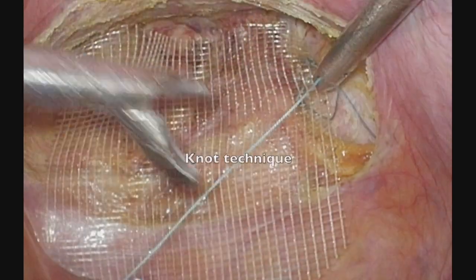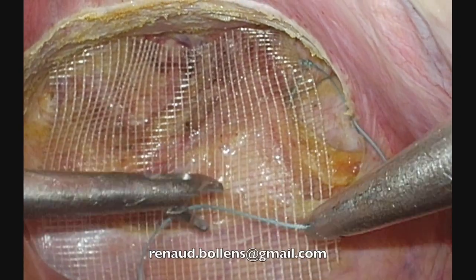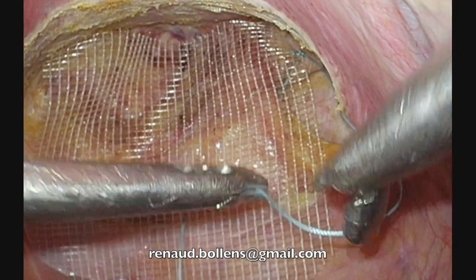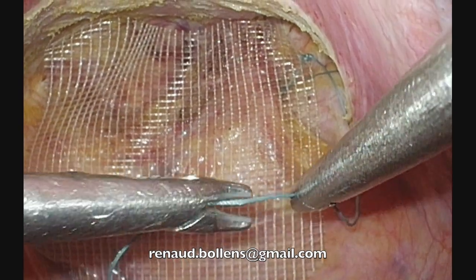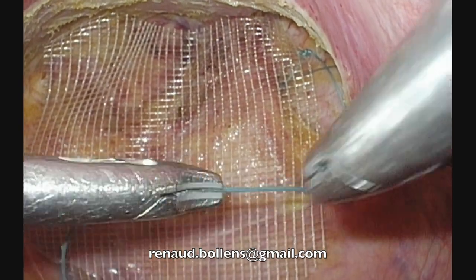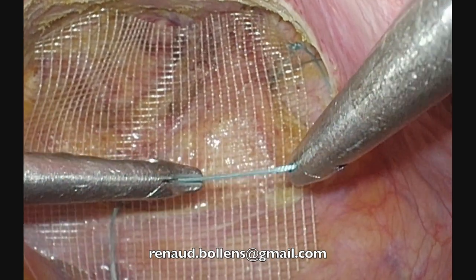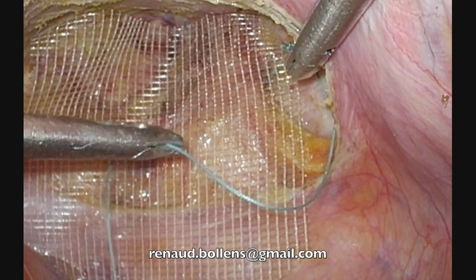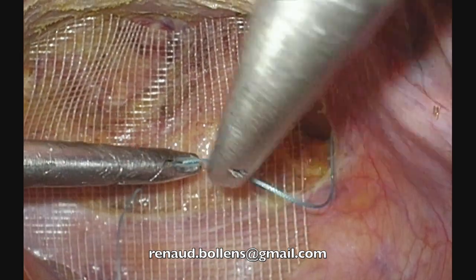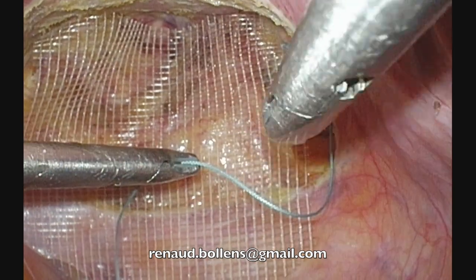Okay? Basic techniques concerning the knot. I catch the suture to have the suture come laterally to the needle driver. Never take the suture with the tip, with the suture going on the tip. It must be laterally from the needle. First step, you turn the left hand to have the suture where you must turn around in the direction of the right needle driver.